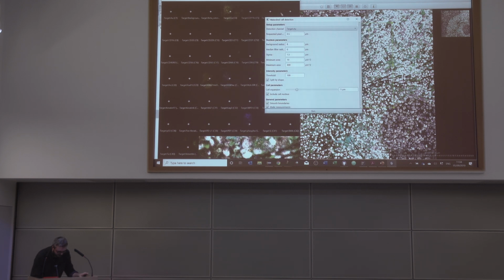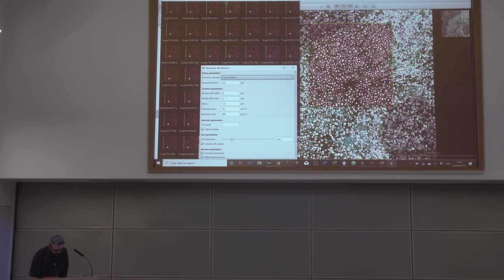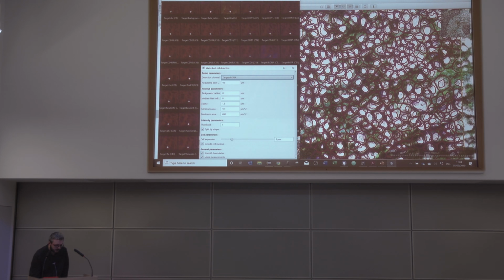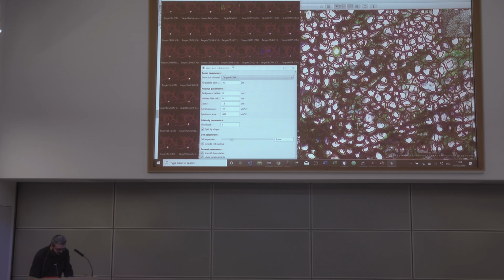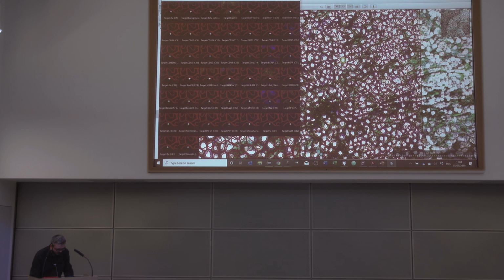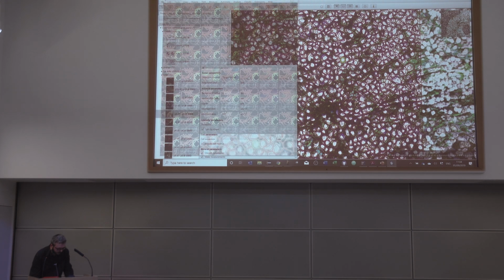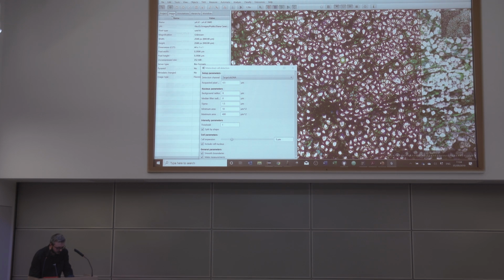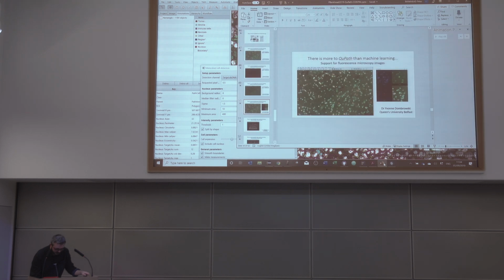If I manage to get the cell detection channel right, I'm going to make a complete guess as to what a suitable threshold would be. You can already run a cell identification of some kind within QuPath, but I think the errors are sufficient that you would really want to come up with something more adapted. But it will enable you to do that, and it will make the measurements in all the different channels currently. So there is a way of representing and extracting the data.